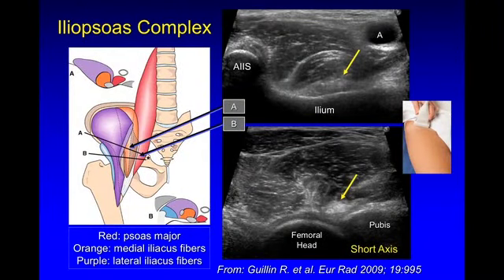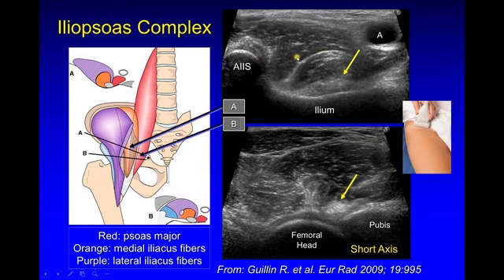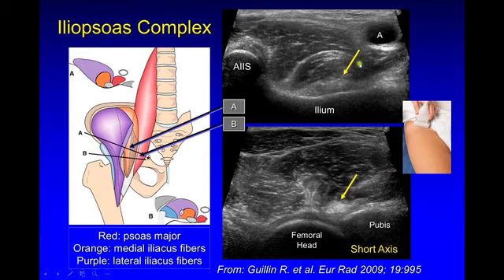Moving on to the iliopsoas complex. On the short axis image, the tendon we have called the iliopsoas tendon is actually the psoas major tendon, because the iliacus portion of the iliopsoas hasn't even formed yet at that level. The muscle belly of the psoas major is here, and here is the iliacus muscle with a lateral part and a medial part. When looking for snapping hip syndrome, the medial part of the iliacus will abnormally get entrapped underneath the psoas major tendon. When that muscle moves out of the way, the tendon will snap and hit the ilium and the superior pubic ramus, creating the snap.